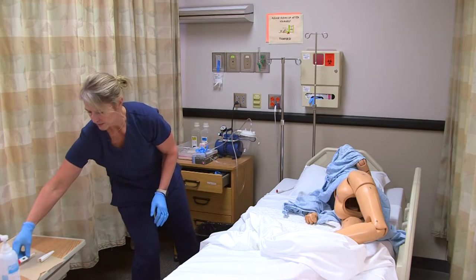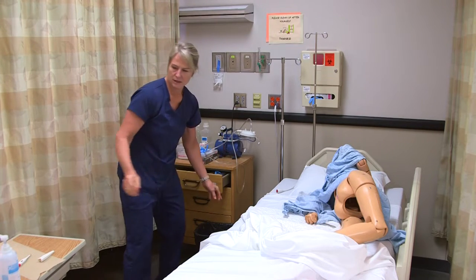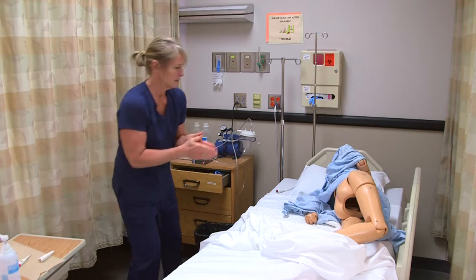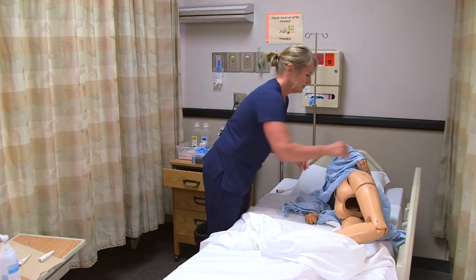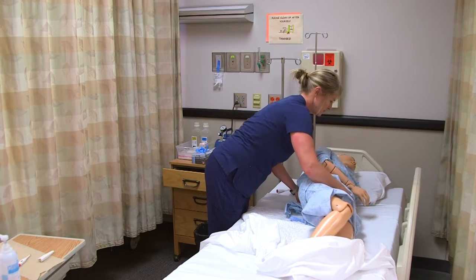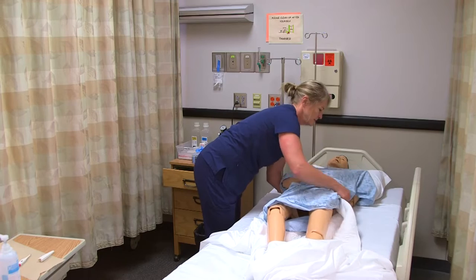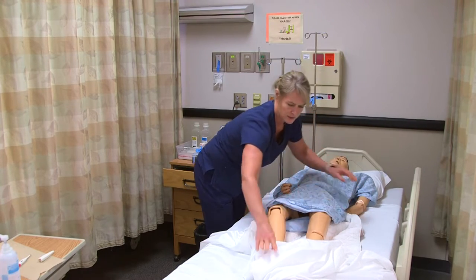I'll put the thermometer back on my barrier and take my gloves off, sanitize, and then get Lee positioned again. 'Lee, I'm going to use the lift sheet to roll you back onto your back — careful over your arm here.'